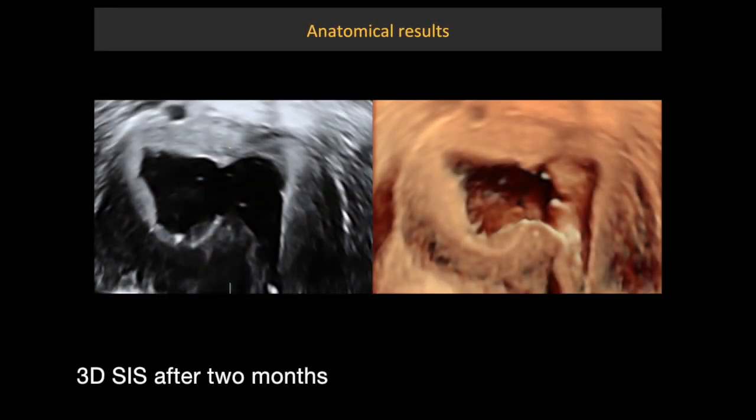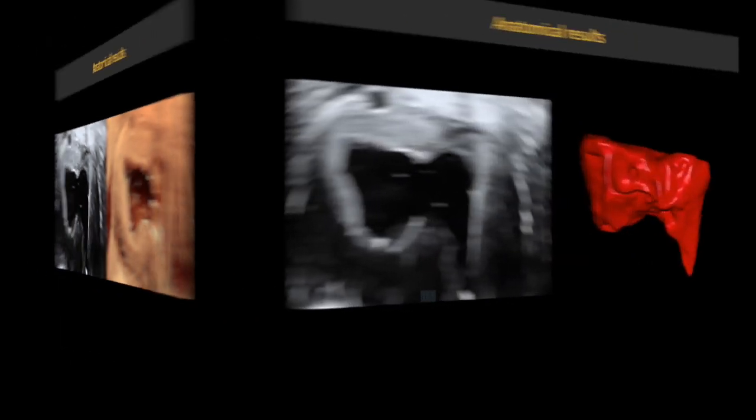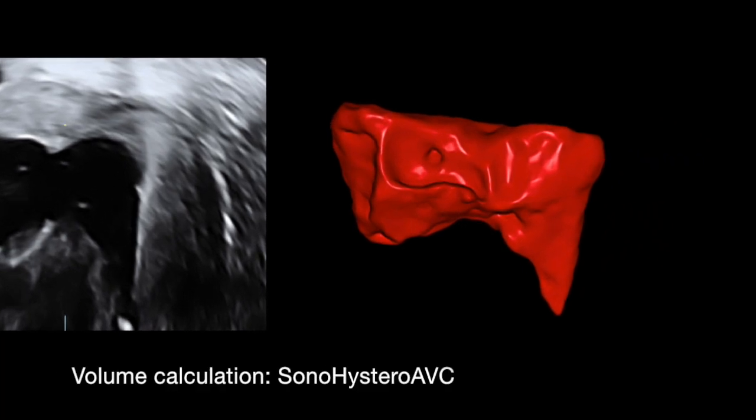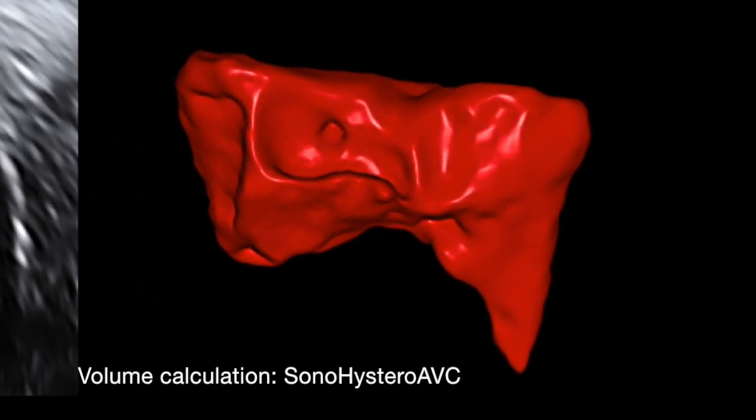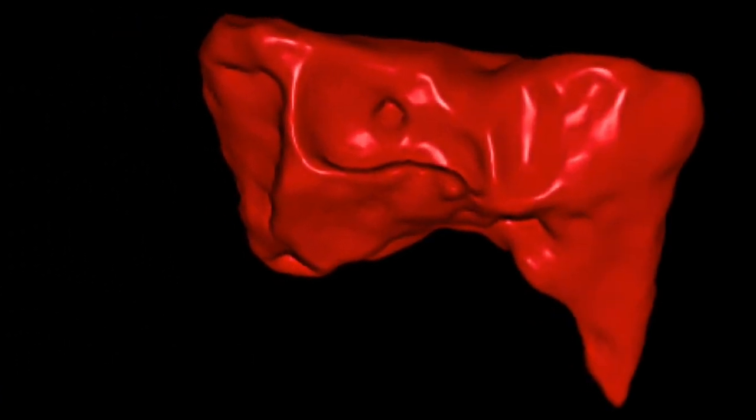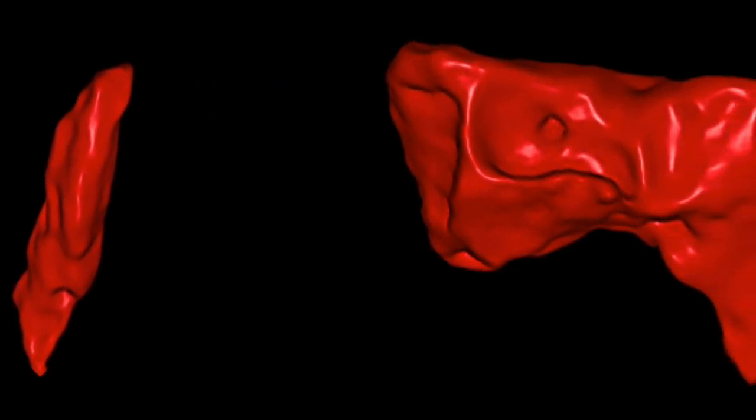At 8 weeks, 3D sonohysterography and automated volume calculation software are used for uterine cavity assessment. In this case, the uterine cavity volume was 9 times higher.